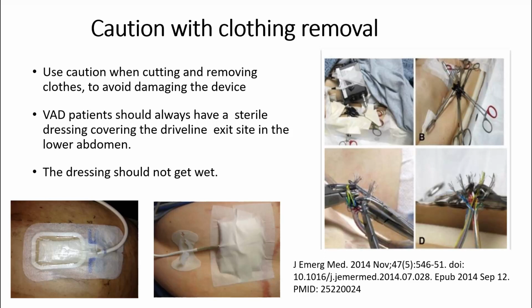So in this particular case, some interesting notes is that the wires are very finicky. They had a lot of problem keeping them in connection. That's why the forceps, and if you look in the top left picture, they're taped in place as the sweet spot. But there are actually 2 different cases of very similar of this happening in the literature. So it could happen again. I certainly hope it's not from an overzealous EMT or paramedic with their super cool Raptor shears or X shears, or I can't really complain because I have monster shears myself, getting cut happy and accidentally cutting these.